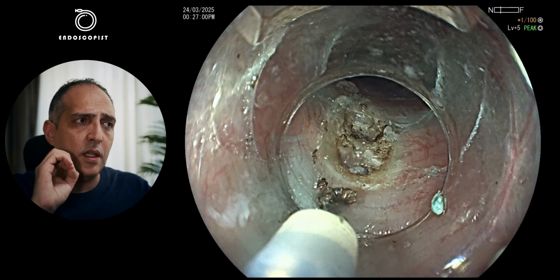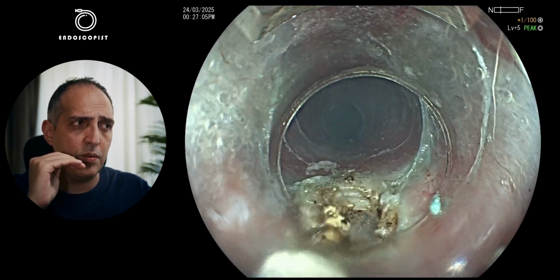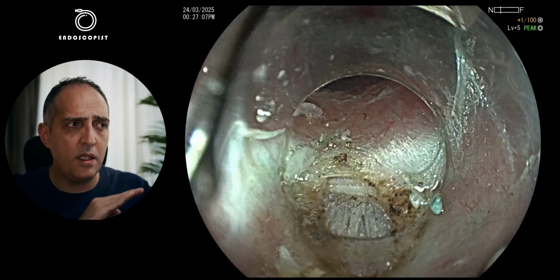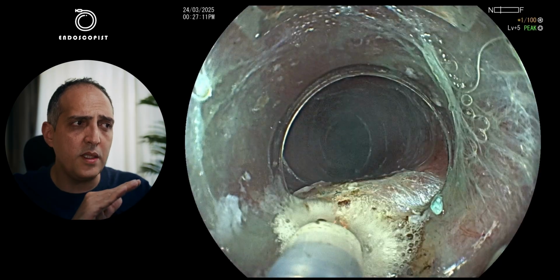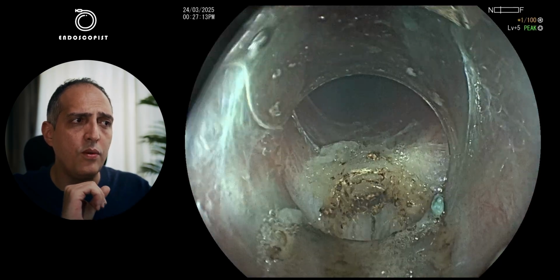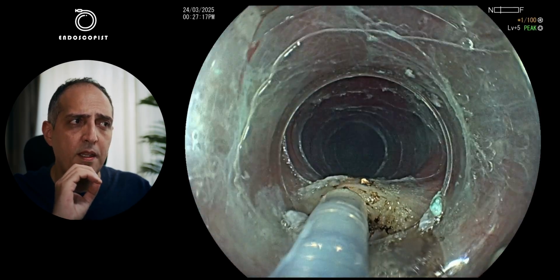Now I start to see the longitudinal muscle, which is a different layer from the circular muscle. Then I will expose it more. Once I see this very clear and nice view of the longitudinal muscle and the circular muscle, that allows me to go for highly selective myotomy, very precise, and also in short time.